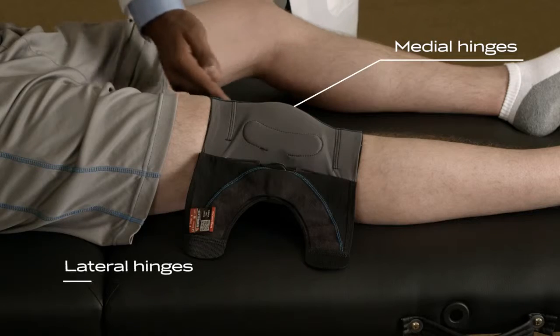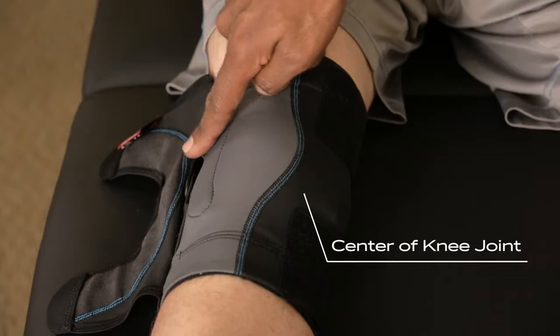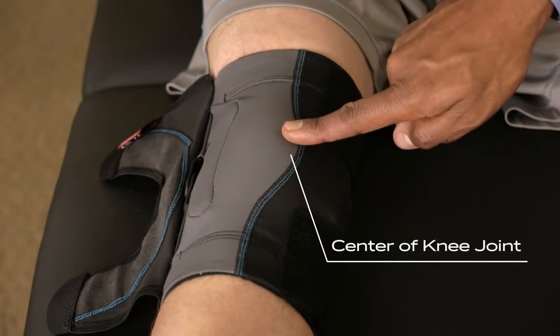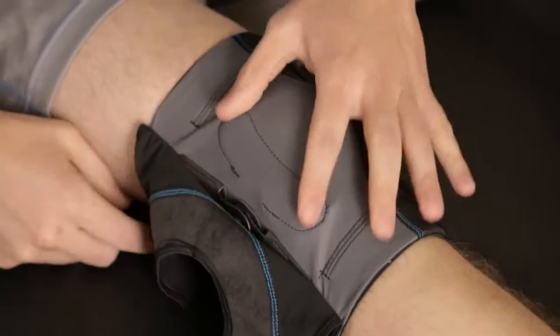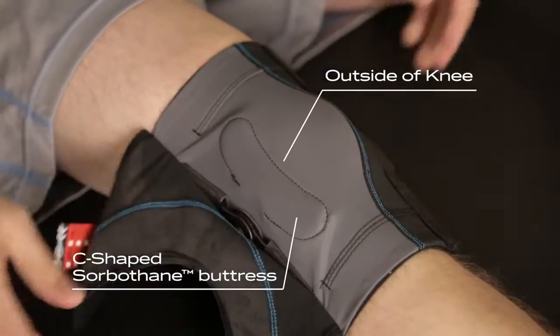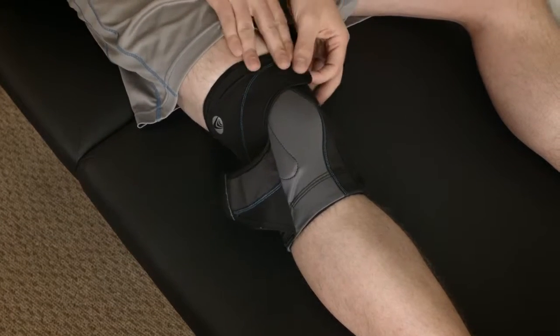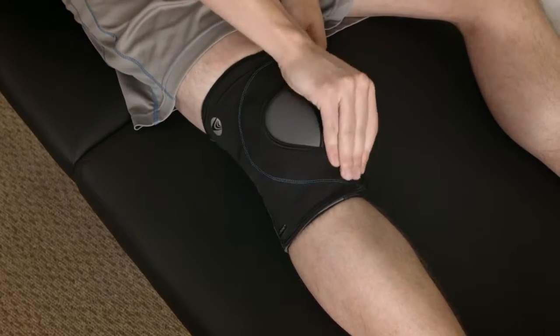You'll see medial and lateral hinges on the outside of the brace. Use these to help you center and align the brace just above the knee joint, just like this. Next, locate the C-shaped Sorbothane buttress and ensure it is on the outside of your kneecap. This innovative material molds to your knee for a personal fit and lateral support. If you'd like added compression, the outer flap can be further secured to provide additional compression to the joint.